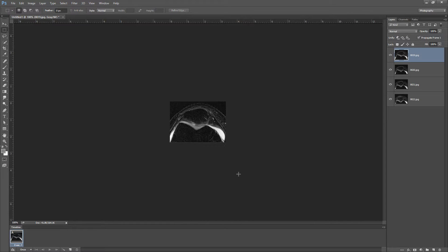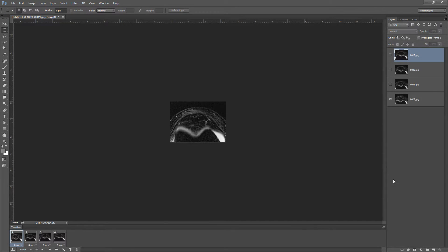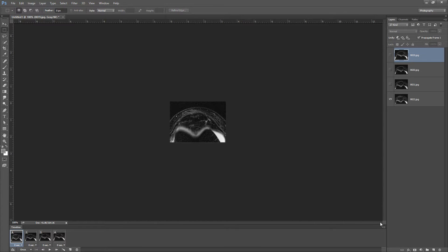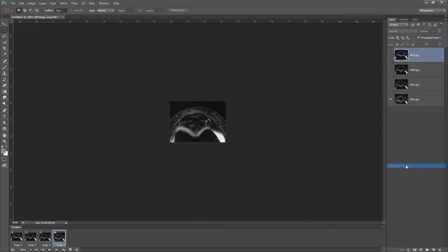We want all of them. So I'm going to go over here in this tiny little drop arrow box to Make Frames from Layers. So now it's populated. Each layer is a frame, but they're actually in the reverse order that I want them. So I'm just going to reverse them, you can go to Reverse Frames here. So now we've reversed their order.